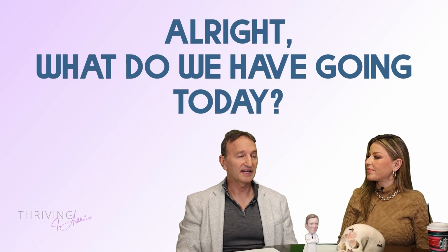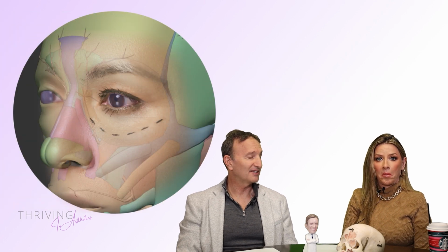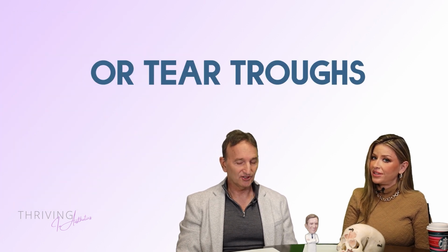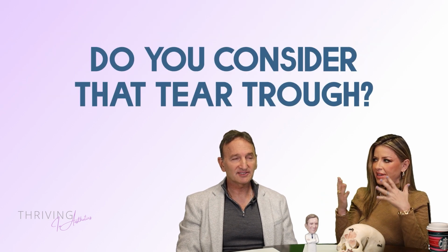All right, what do we got going today? I think you're going to teach us how to inject the infraorbital hollows. Infraorbital hollows, or tear troughs. Tear troughs, another way of looking at it. Do you consider it all the same? Even the lateral infraorbital hollow? Do you consider that tear trough?